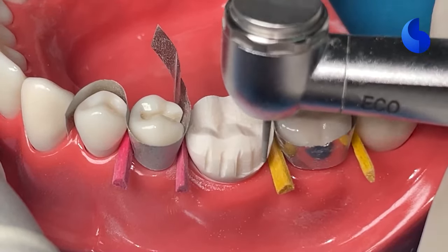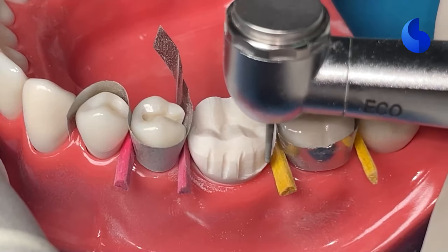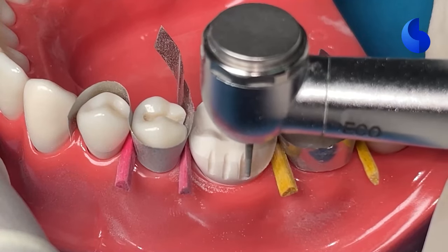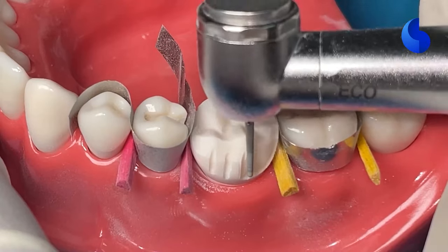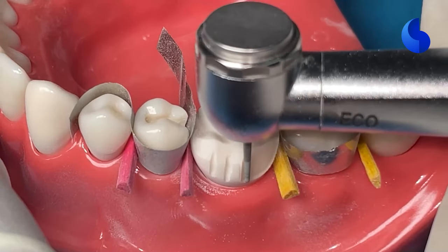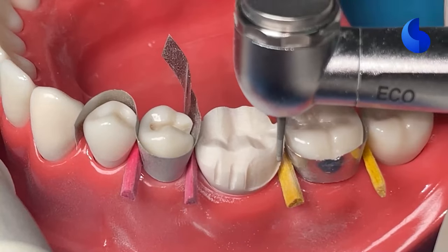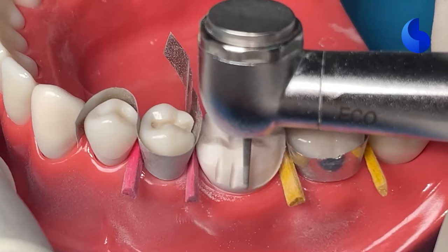Now you can remove the islands of tooth structure between your depth orientation grooves while you're also painting your finish line. When I say painting your finish line, you're making sure that you don't have any ditches or undercuts, and it's just a smooth flowing finish line placed about 0.5 millimeters supragingivally.